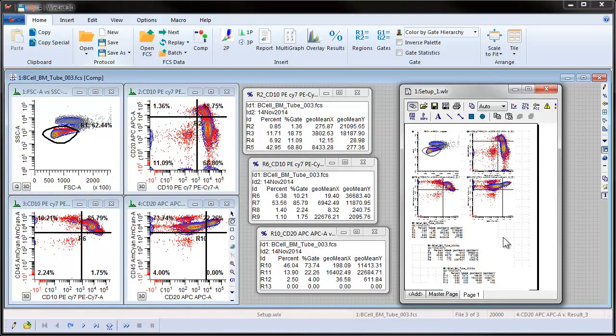In this tutorial, we have seen how quickly and efficiently WinList helps you build an analysis setup. In just a few minutes, we were able to create histograms, draw regions, apply gates, and generate quad stat statistics.